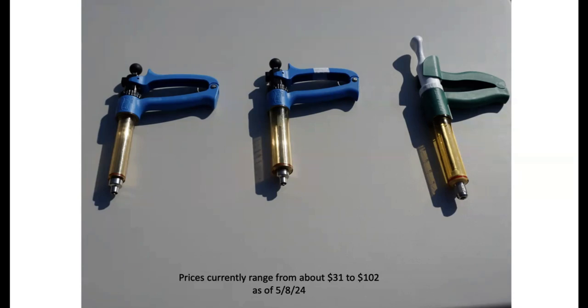So I hadn't talked about it yet, but we always want to change needles if that needle gets dull, if it gets dirty, if it gets bent. If it gets bent, definitely don't try to straighten it out, get you another one. The other thing is we never want to go back into the bottle with a dirty needle. And if the needle hasn't gotten dull, hasn't gotten dirty, then the rule of thumb is to change it every 10 to 12 head.